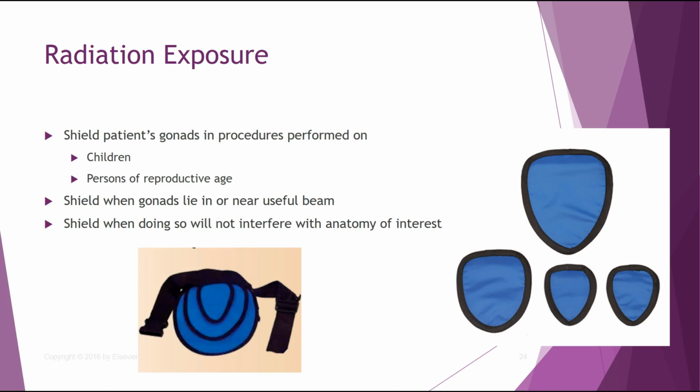Hopefully, though, in your experience, you can have sufficient individuals on the OR team trained that know, and their shields kept in the OR for this purpose, so that when they're positioning the patient before the surgery even starts, after they've been anesthetized, you're going to want them to position shielding appropriately.